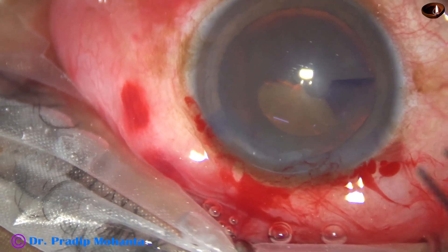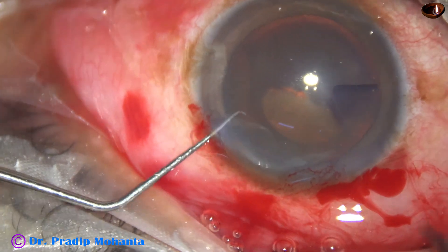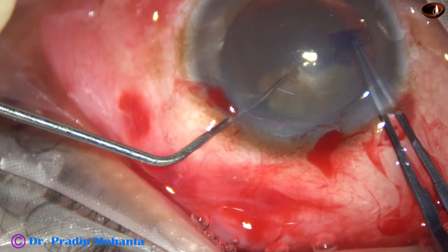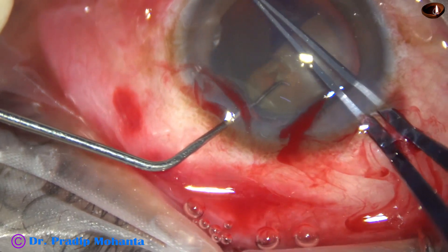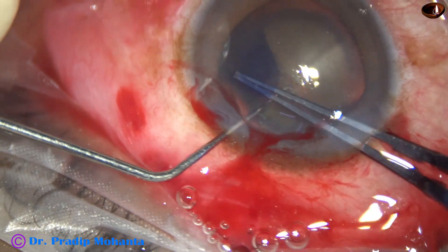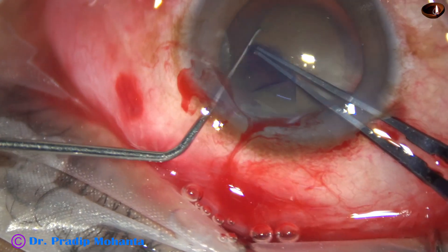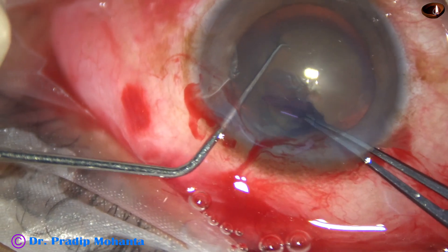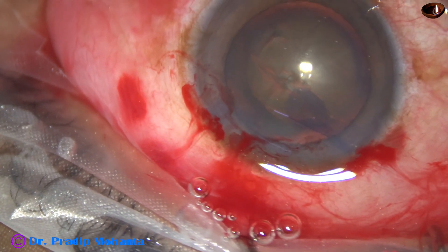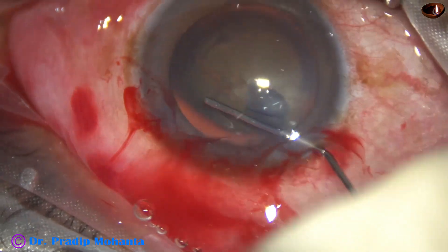I come out and inject some visco. As I hold the capsular tag, I support the lens mass with the Sinski hook, make the lens mass stable, and complete the rhexis. A nice round rhexis of 5.5 millimeters has been done.